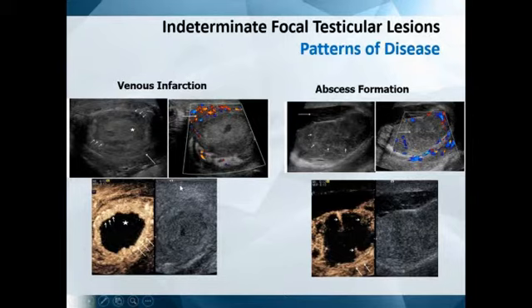an abscess. And you can see with the contrast-enhanced ultrasound that the border is well demarcated, clean, as opposed to the abscess, which is irregular with septations, very different. It is up to the clinician and the patient's condition whether or not this is treated conservatively with intravenous antibiotics, or if there is no real use in preserving the testes, then to do an orchidectomy for symptomatic relief. This you can wait, it will resolve, the patient's testes will be smaller, but he will retain testicular tissue.